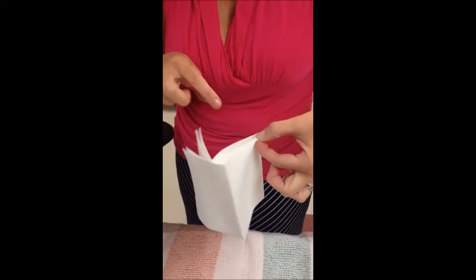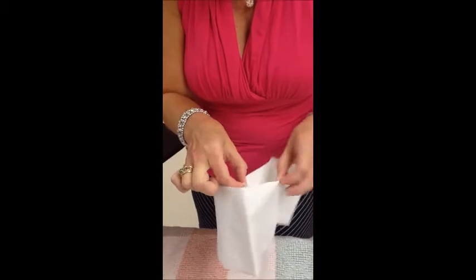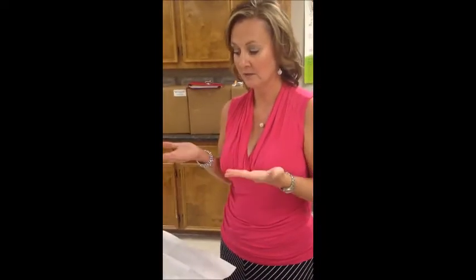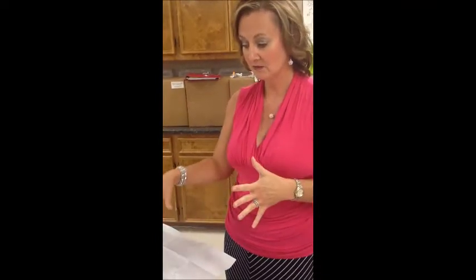Now, if you'll notice, I'm touching the part of the drape that is the edge, but it's also the middle. So I've contaminated my drape. The way this was packaged, the only solution that we came up with was to go ahead and open this and use the shiny side as your sterile field. We know that the shiny side is normally supposed to be down because it would prevent fluids from being wicked through. But with the package the way that it is, this is still sterile, and that's the way we're going to have to do this.